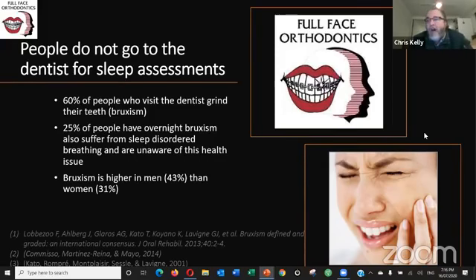So if you're relying on a sleep test from a dedicated sleep modality, you probably are going to get a lot of negatives when you could actually be detecting things. I think that's because they're using the EMG on the leg, right? As a result, they're not going to pick up any concomitant facial myoclonus, whereas we as dentists, that's what we want to look at, right? So EMG on the cheeks is an important thing.